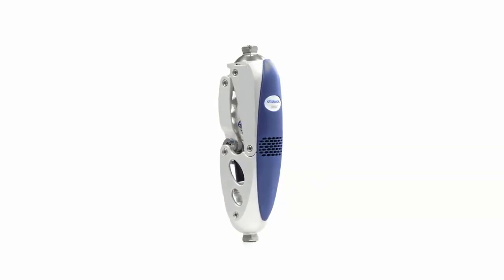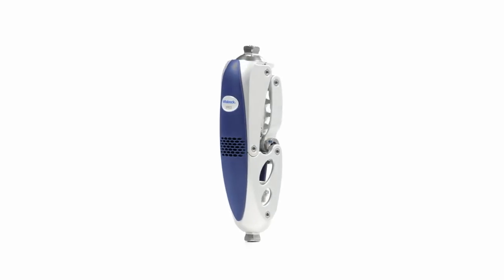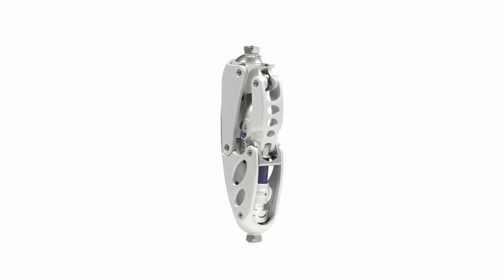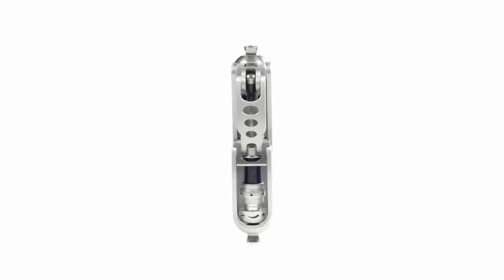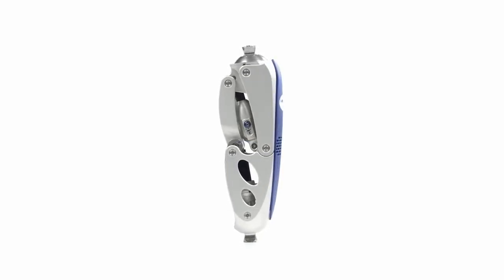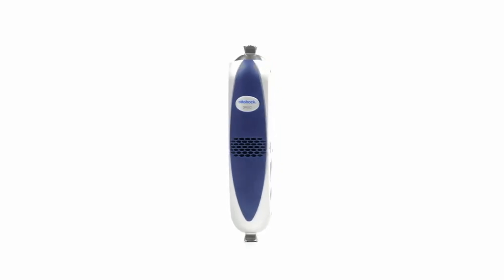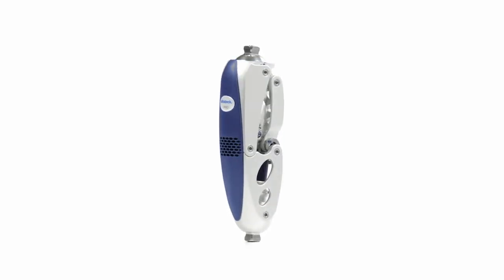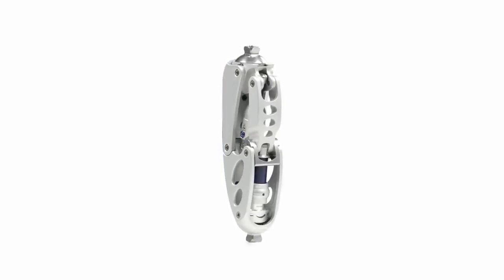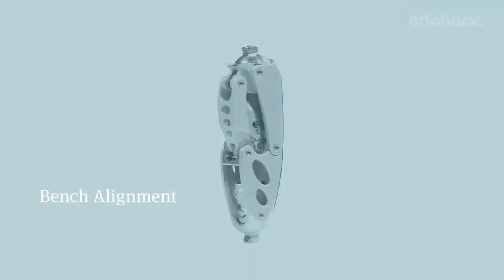The polycentric knee joint 3R60 with hydraulic swing phase control is recommended mainly for Mobis 3 lower limb amputees with a body weight up to 125 kilograms. The unique characteristic of the 3R60 is its ergonomically balanced stride, EBS, which allows for a cushioned stance flexion of up to 15 degrees, taking place without initiating normal swing flexion. This stance phase flexion creates shock-absorbing comfort at heel strike, as well as additional stability for the user.